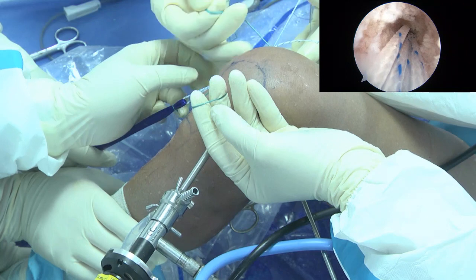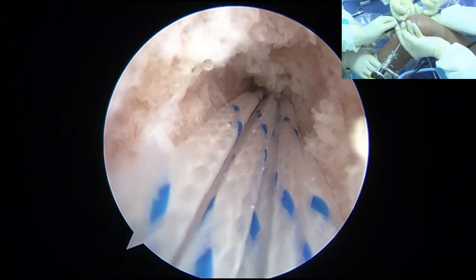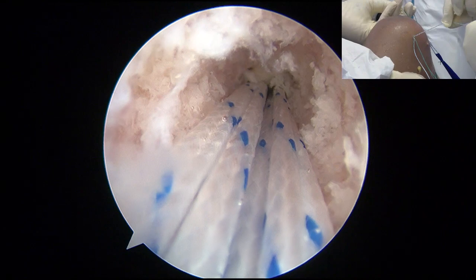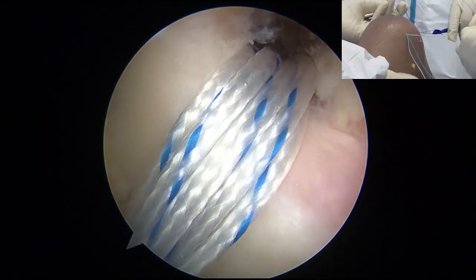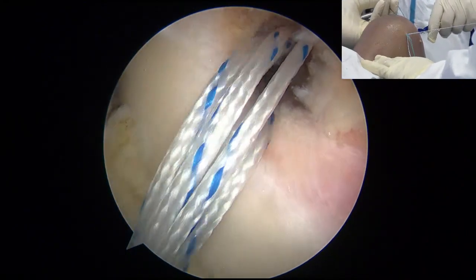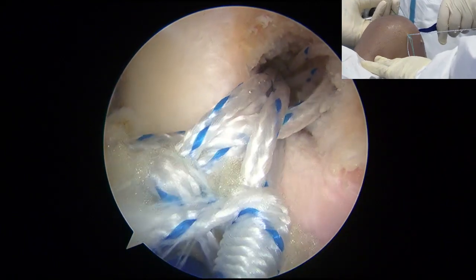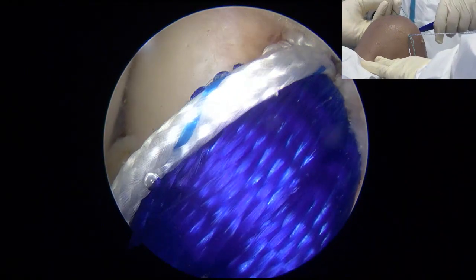然后呢，就拉着胎板两侧的线, flipping. Good flipping. And then the next step is pulling this one. Okay, in. Very good. 然后呢，确保胎板已经在体外了，就拉中间的花线。Very good. Going. It's coming up. Very good.